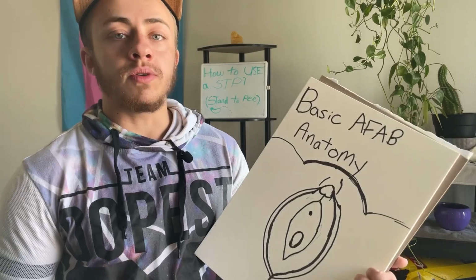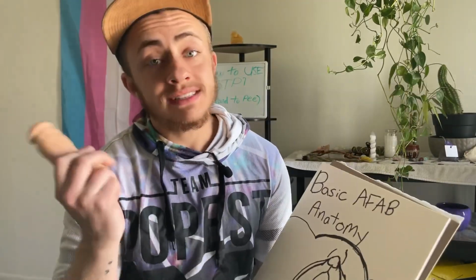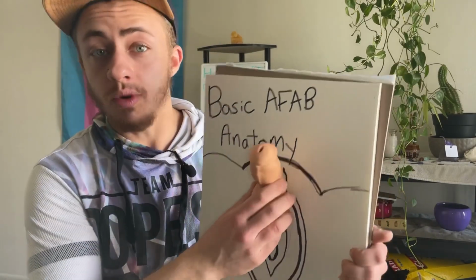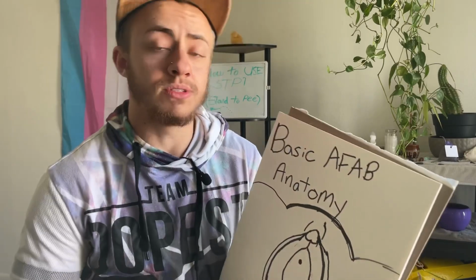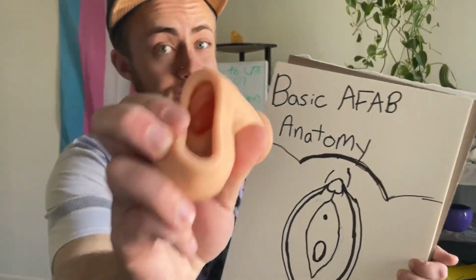What you're gonna wanna do is find your urethra. I would even recommend getting a mirror and trying to figure out exactly where it's at on your body. Depending on the STP and everybody's personal bodies, sometimes you would be able to actually put your bottom growth inside the STP hole, but I feel like to be able to get the most space as possible to prevent the most backflow as possible, just aim yourself and your urethra straight down that hole.